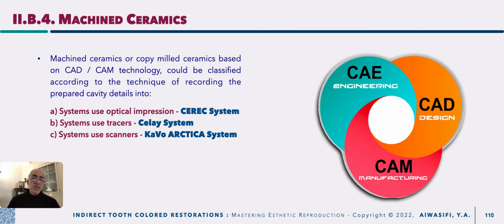Okay, it is simply similar to your computer unit. If you are a graphic designer, then you should have a camera to capture the view, and then this digital camera should transmit your view or your photograph to CPU, where there is a software that manipulates those pictures, and redesign them, reshape them if needed, and finally comes the printer, which is equivalent to our copy milling machine that also copy and print your photographic design or graphic design either in a photo paper or a normal paper, in black and white or in colored. It is typically the same.